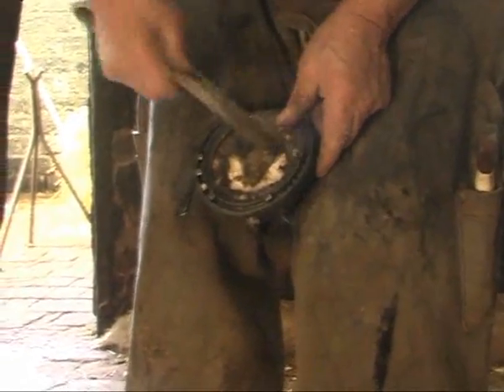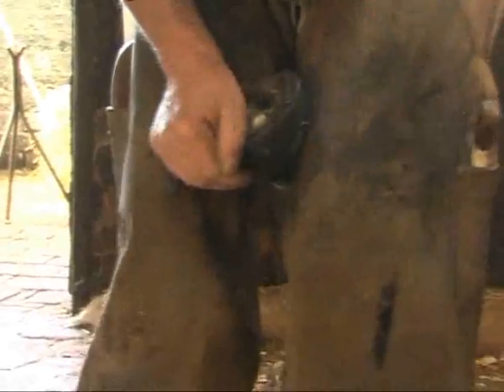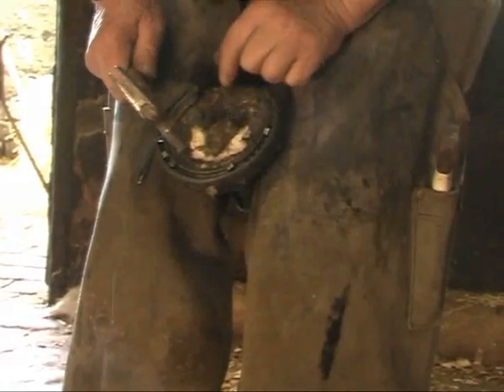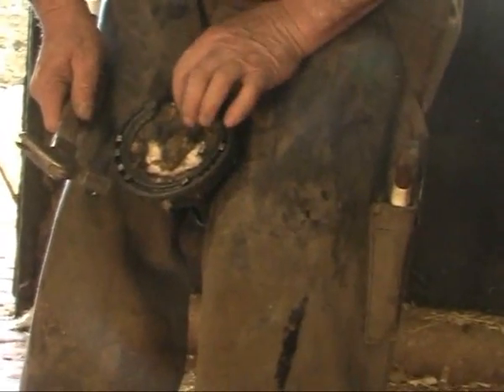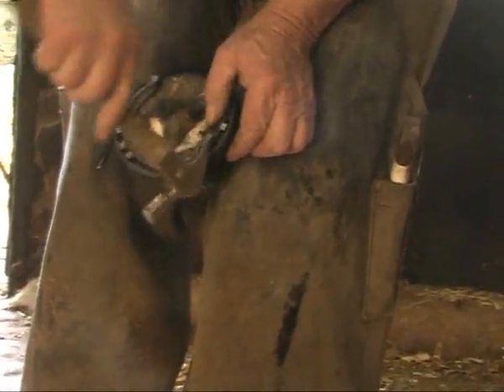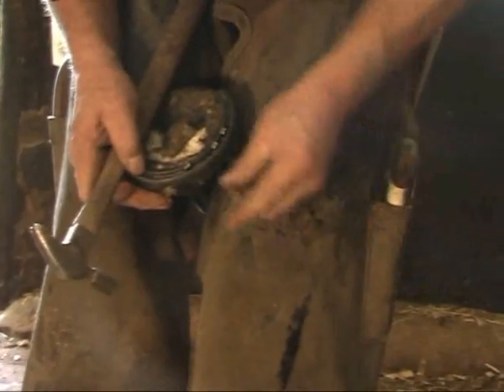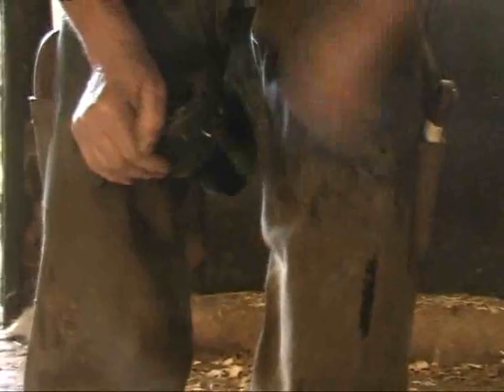This horse would normally have a size 3 Machead MMC shoe on it. With this prosthesis on it, it's gone up to a size 4. The prosthesis has not only given it width this way, it's given it length and depth as well. With the thoroughbred ratio, the toe is three times the length of the heel, so adding equal depth front and back elevates the heel — and heel compression is one of the big problems. As I see it, this has three or four different mediums that improve the conformation of the horse's foot, which is probably why we're having such good success and why the feet are actually regenerating very well underneath it.